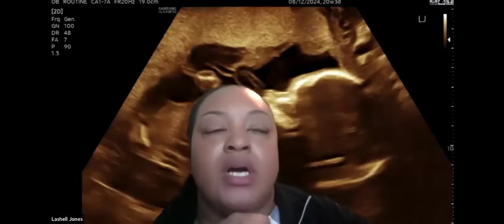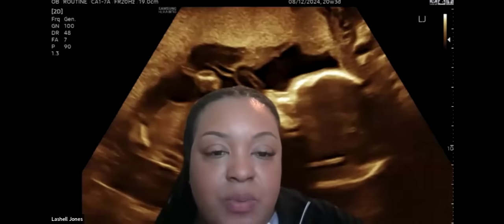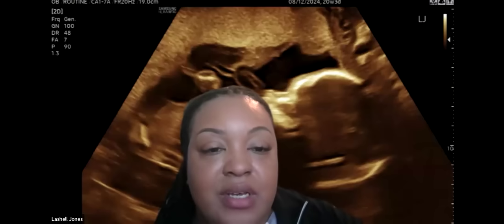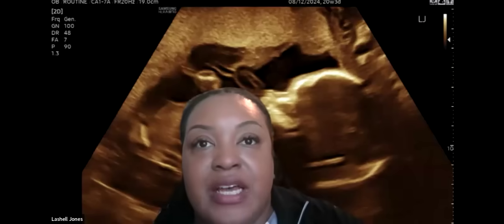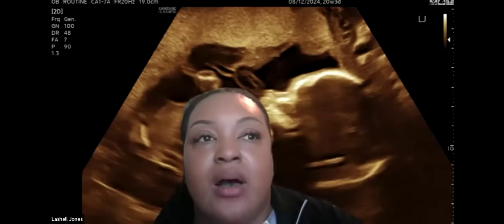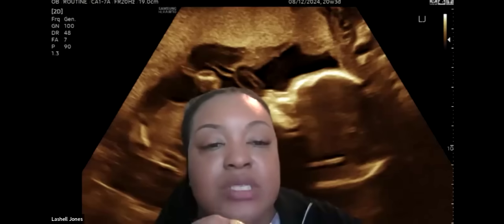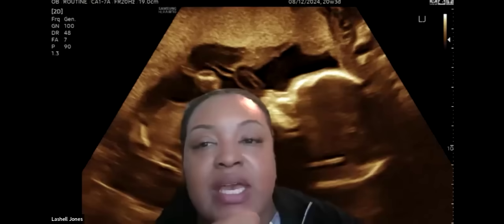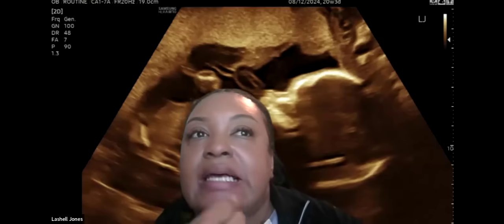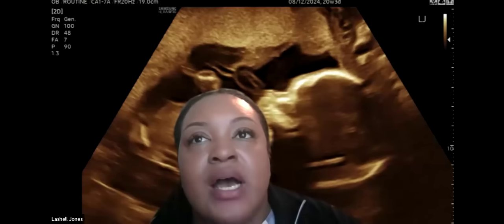Now, early on, we do not utilize the pulse Doppler because of the risk, but in the case of like for that trisomy 21, we briefly used it to help with the diagnosis. It was brief, just to help in that particular case, but it's not something that's standard, only because of the risk that it carries.